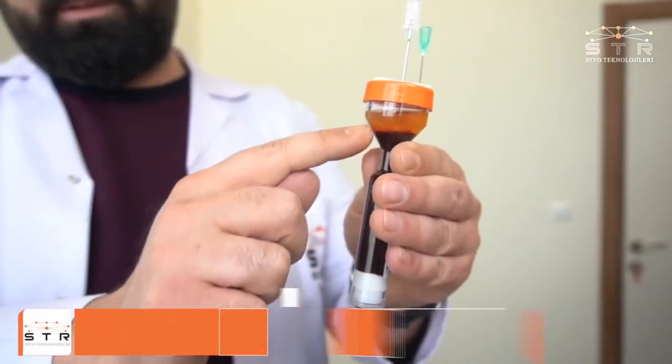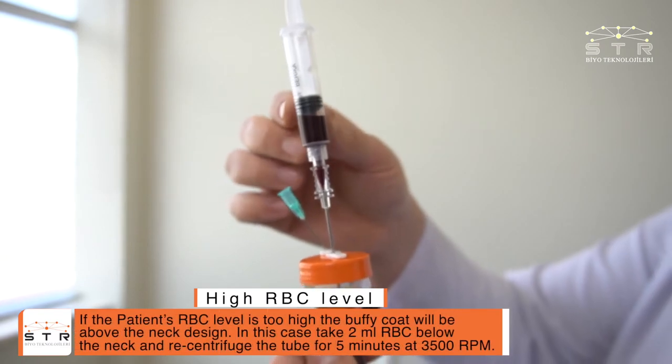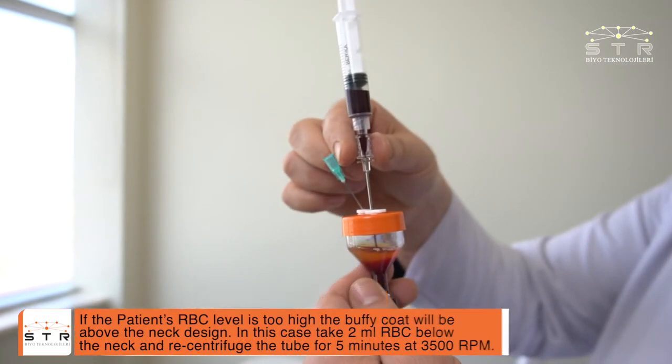If the patient's RBC level is too high, the buffy coat will be above the neck design. In this case, take 2 milliliters of RBC below the neck and recentrifuge the tube for 5 minutes at 3500 rpm.